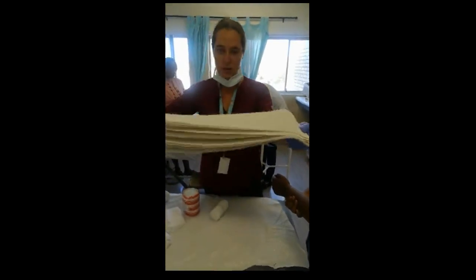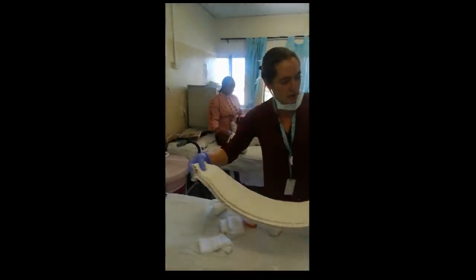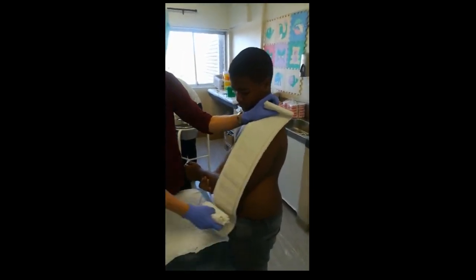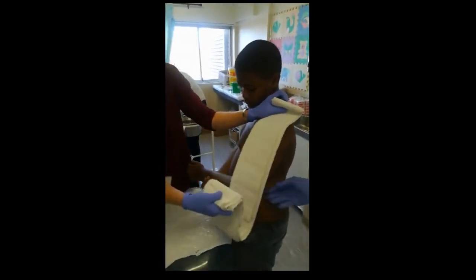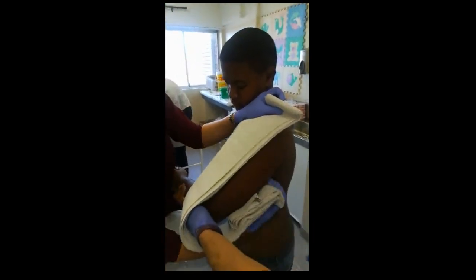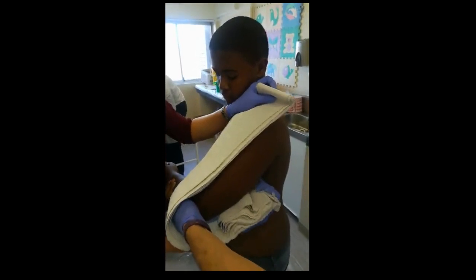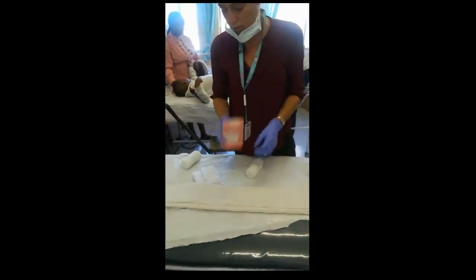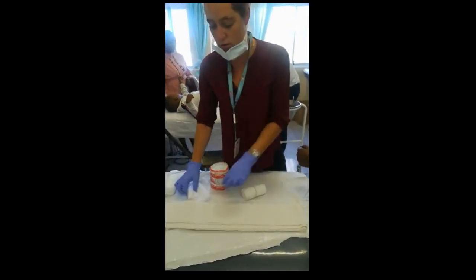What you'll need is a slab that you've measured based on the width from the top of the shoulder, with a little bit extra, and around the humerus on the inside up to the axilla. This is the length of the slab you'll need. Then you need your padding, bandages, and two slings.